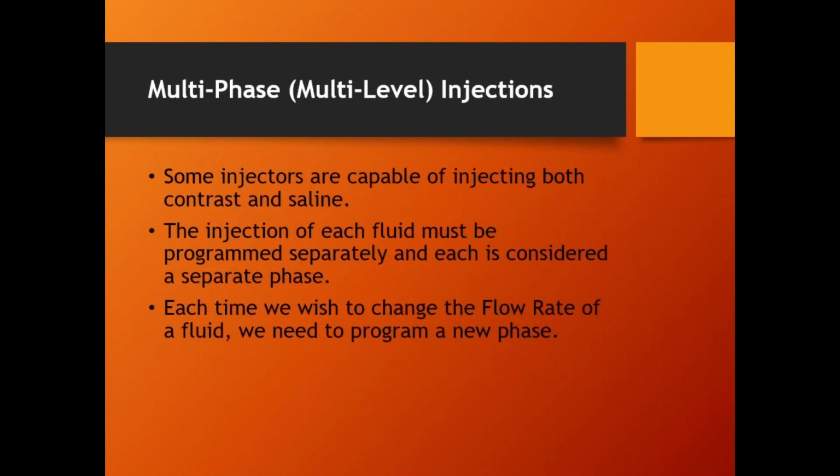All right. Multiphase injections. Every injector on the planet calls them multiphase except one that calls it multi-level. It's exactly the same thing. This right here is a multiphase injection. Let me reset. All right.